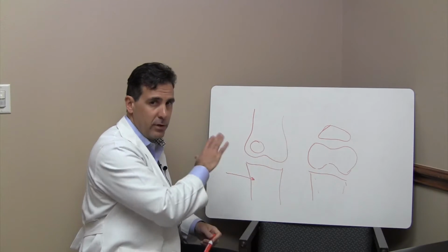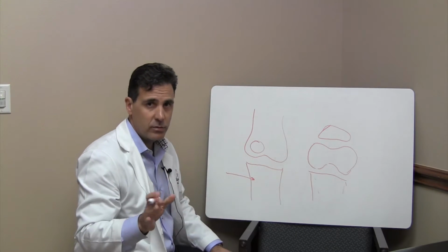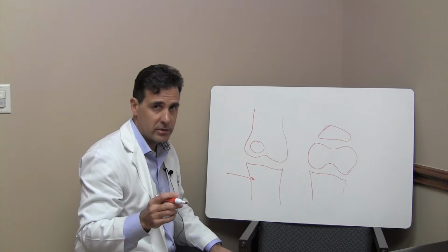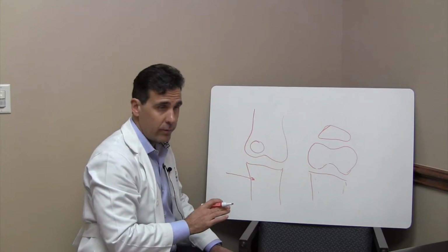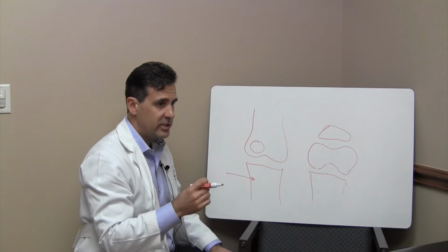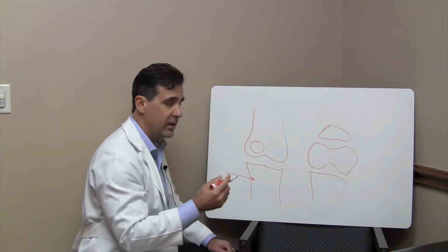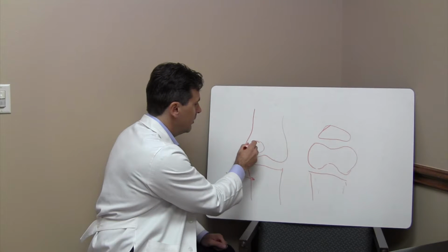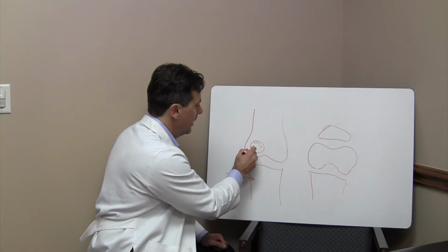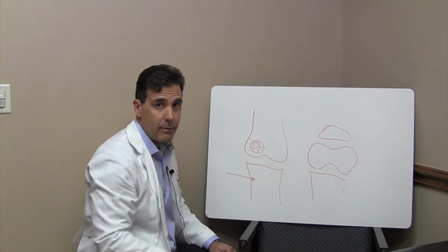You remove the calcified layer, expose the bone, and instead of drilling holes like in the last one, which was called a microfracture and was part of the BioCartilage technique, with this one you do not drill holes. You leave that subchondral plate alone, and then you take the graft, which is actually live chondral cells. It's juvenile chondral cells, so you actually have very, very immature chondrocytes or cartilage cells, and they come in a little pack, like little cubes or little blocks, and we lay them in the defect. They spread them out all over the defect, and then we put the glue base on top of it again.